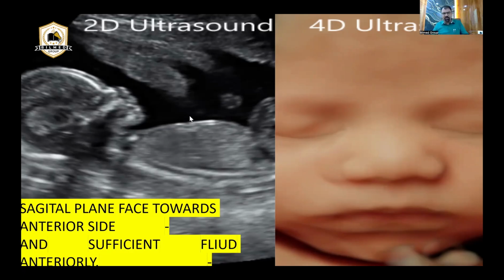So the basic important point is that a good sagittal section, when I am taking the fetal face, with sufficient fluid in between the anterior part, whatever it can be, a placenta, a maternal wall, uterine wall, anything, and there should be some fluid, and you have to take your 4D and put over here. So the basic important point is that 4D ultrasound is nothing but a superimposed 4D on a good 2D ultrasound.